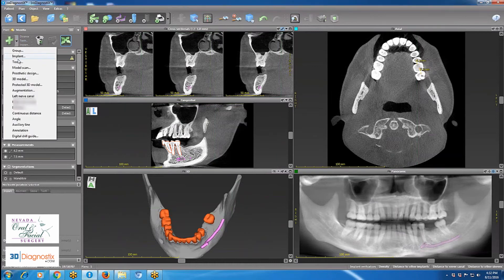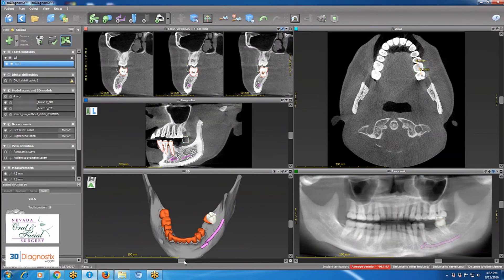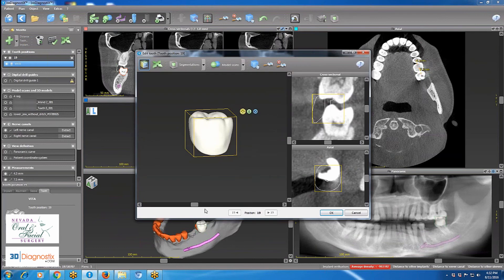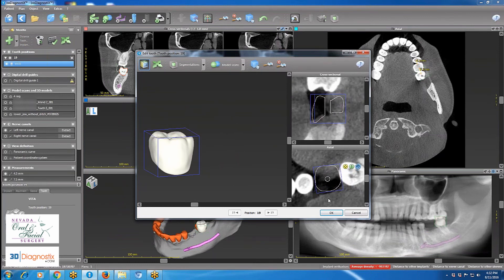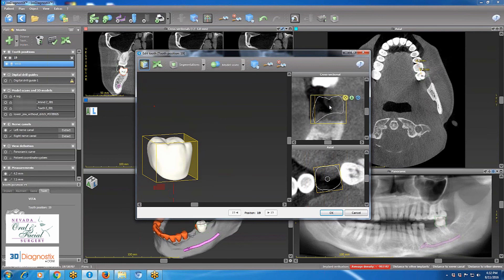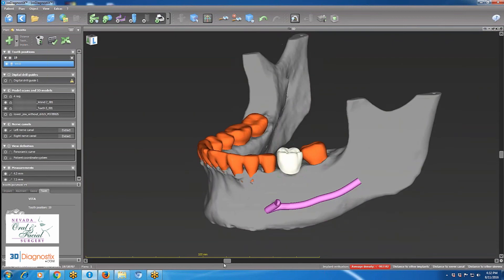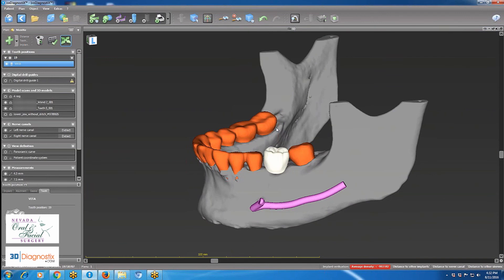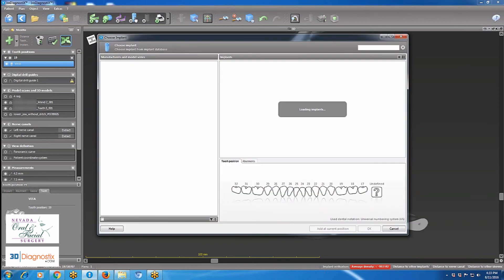We will be placing one implant in missing site number 19. Step one: I add a virtual crown at the missing site. Double-clicking on the crown allows me to change the position, angulation, and size. After placing it in the most ideal position in terms of angulation and position, I click OK and view it in the 3D view. I can still tweak it by right-clicking to change angulation or left-clicking and holding to change position, placing it in the most perfect position relative to the adjacent teeth.